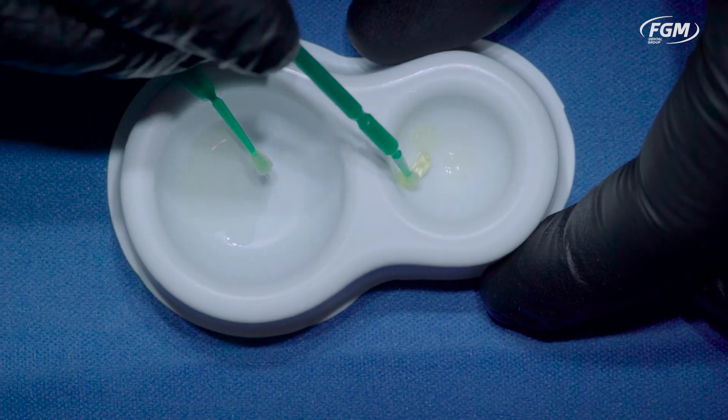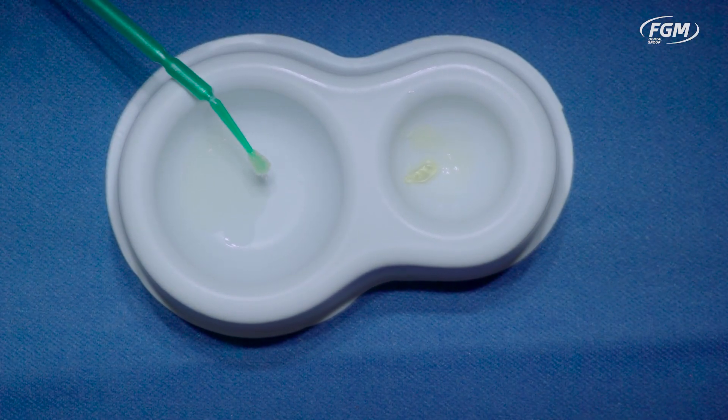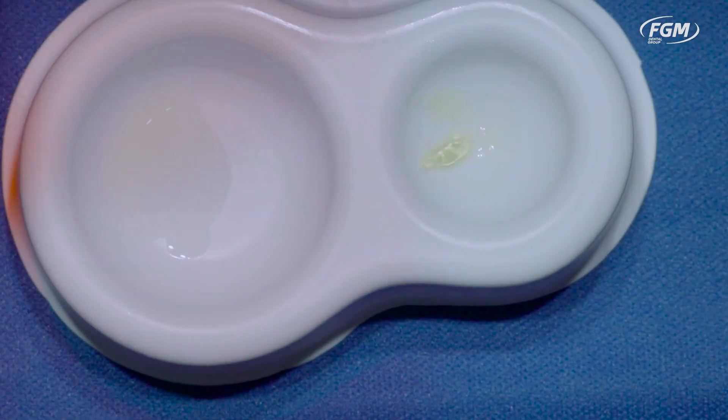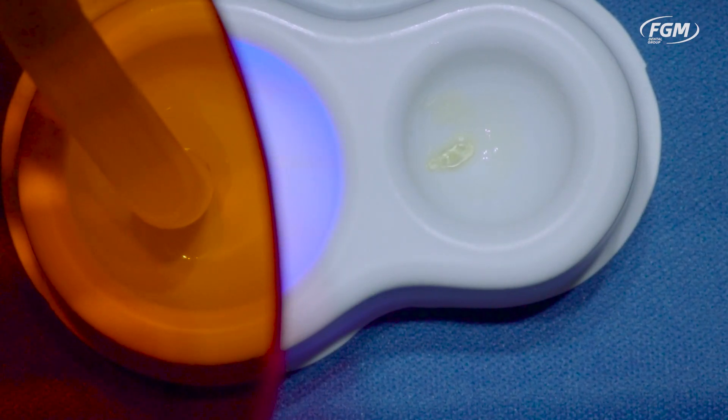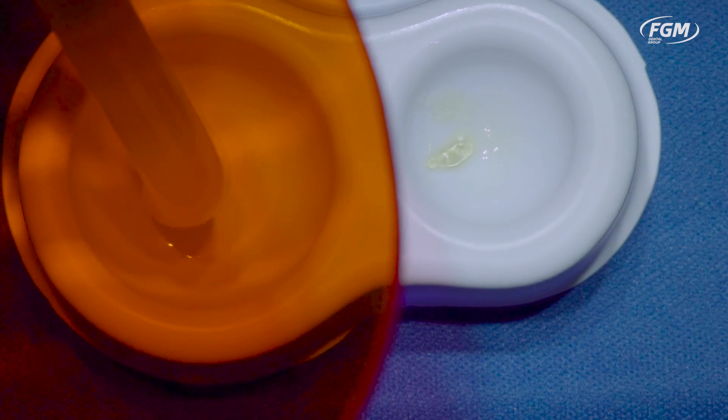And we're going to zap it with the light, and even after that, you'll see there's quite a slight difference, meaning a transparent adhesive is more beneficial when you're doing aesthetic dentistry.